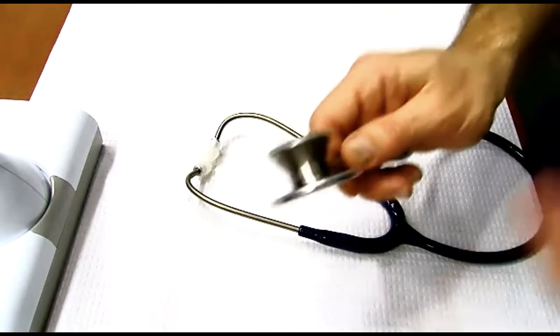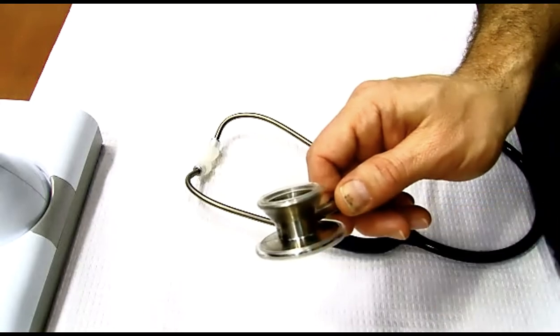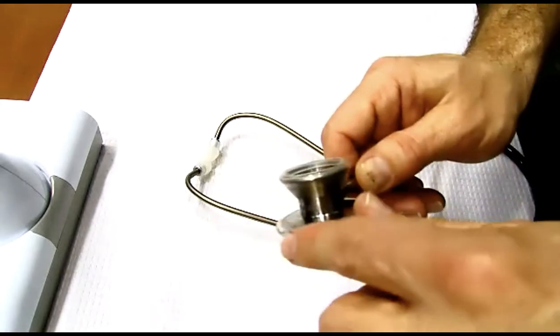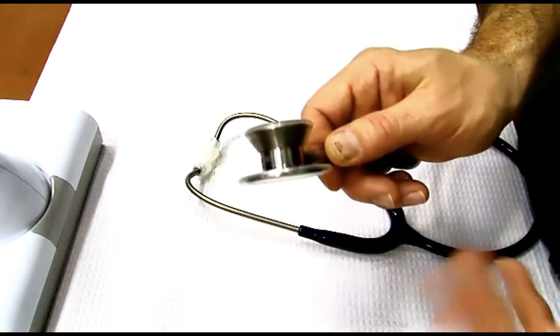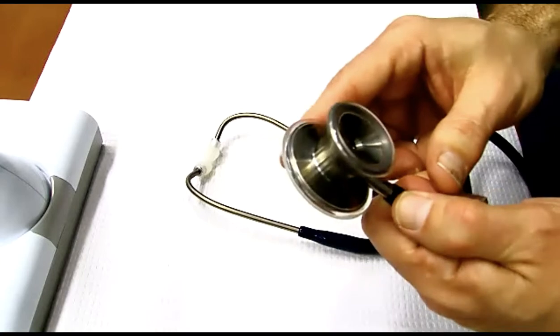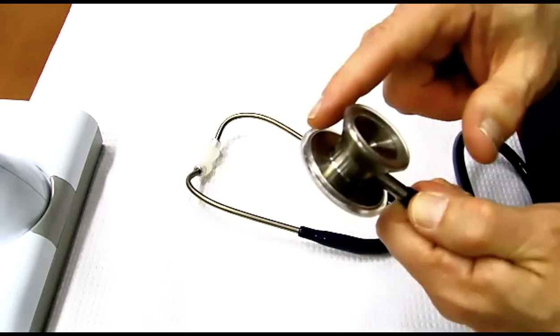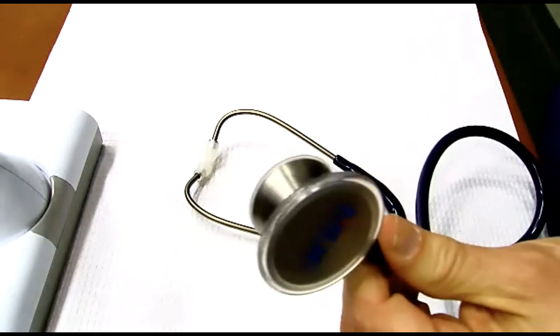So today you've got three people you're practicing on. Try it with the diaphragm. And then the next time you do it, try it with the bell. If you don't like it, go back to the other. So you're going to have to go back and forth and find out for yourself which side works better. But truly, trust me, even if you hear it just fine with the diaphragm, try the bell, or the opposite, because you may find one that definitely seems to be better for you.